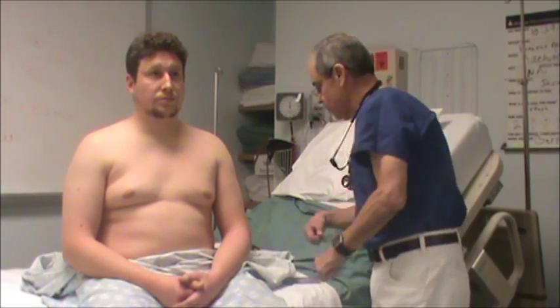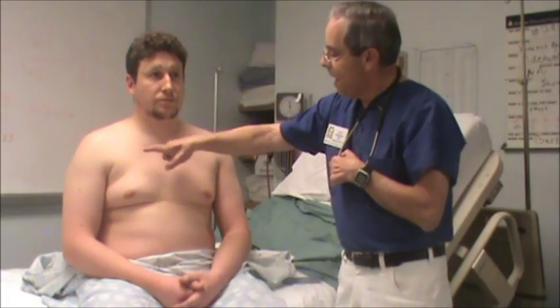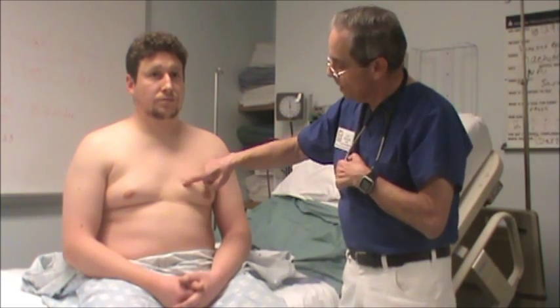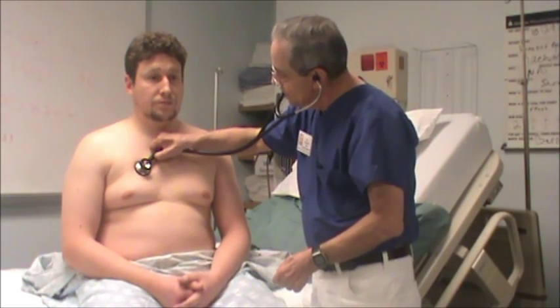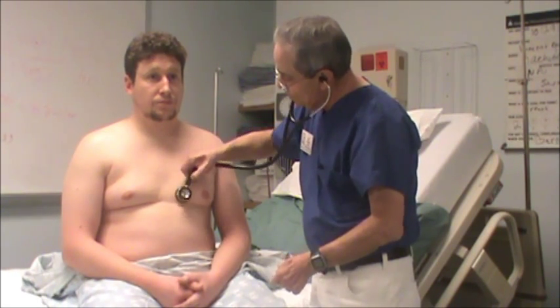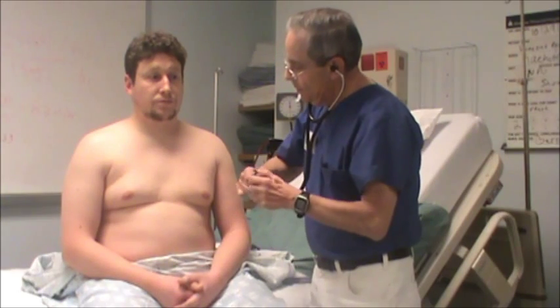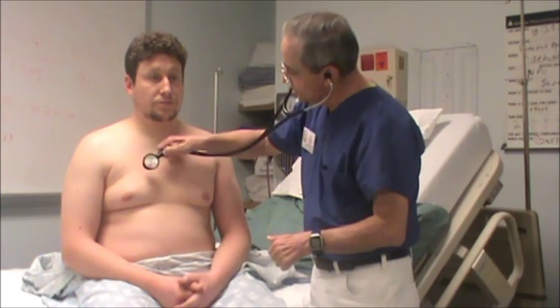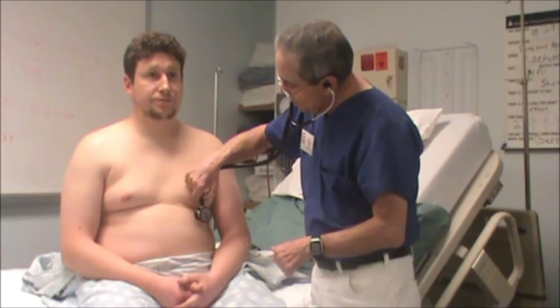Once we do that, we're going to do our auscultation. Remember that there are 4 areas where you auscultate: aortic, pulmonic, tricuspid, and mitral. Take your stethoscope and start with your diaphragm first. Aortic, pulmonic, tricuspid, and mitral. Then use your bell and complete the same process. Aortic, pulmonic, tricuspid, and mitral.